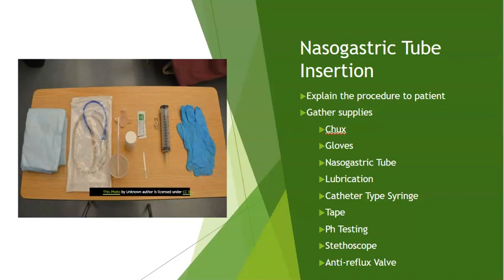We're going to talk about it. We're going to talk you through it. I want you to try to follow directions. It's always very important. It really does help the patient do well with the procedure. You're going to gather your supplies.